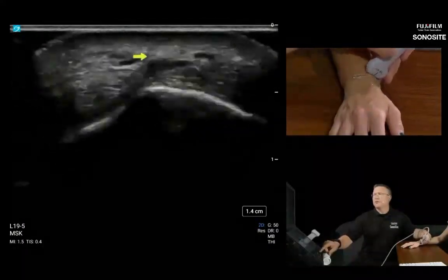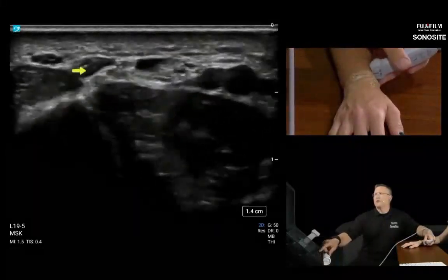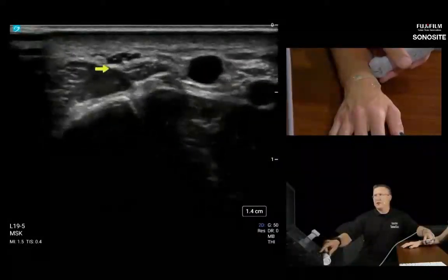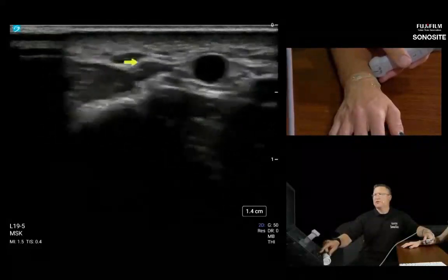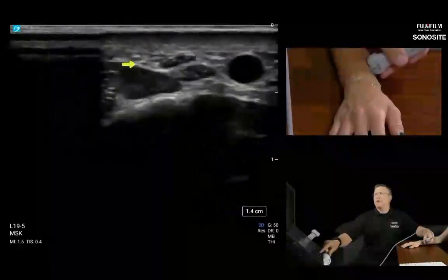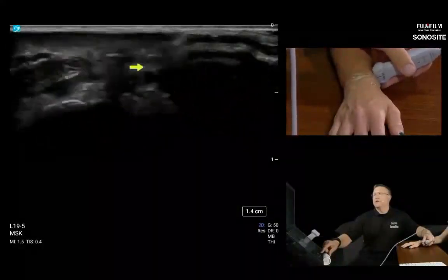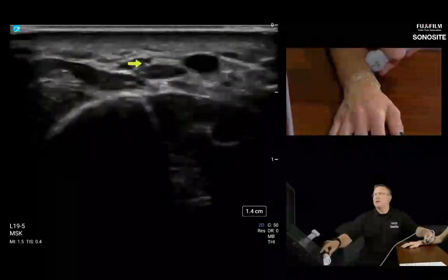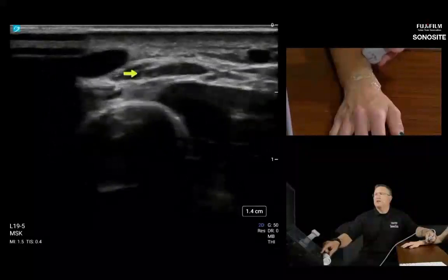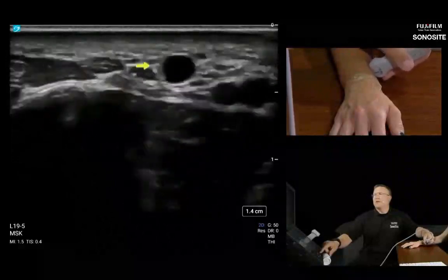As you go more proximally, it will meet up with a cephalic vein here. So here's our cephalic vein, and here's our superficial radial nerve. You remember from the elbow when we evaluated this, it keeps going and there's lots of branches to follow. This is the more radial branch of the radial nerve, called the superficial radial nerve, and it will bifurcate and then trifurcate to multiple sensory and motor branches. But right now we're just going to focus on, do we see any neuromas, schwannomas, compression neuropathies, or tenosynovitis that might be compressing on these little nerves.